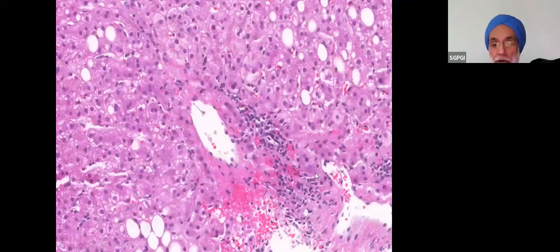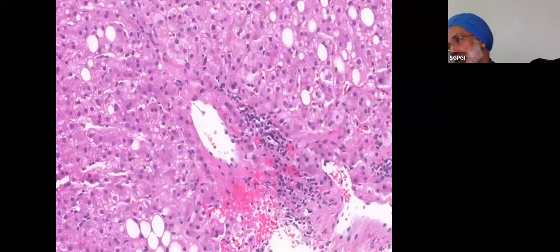If you see central venulitis and dropout, then the conventional teaching is this is not hepatitis, this is rejection, but it can be recurrent autoimmune hepatitis. Because if alloimmune hepatitis can damage the portal vein and the central vein, the autoimmune hepatitis can do the same thing in the same area.